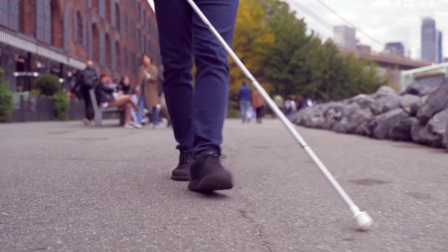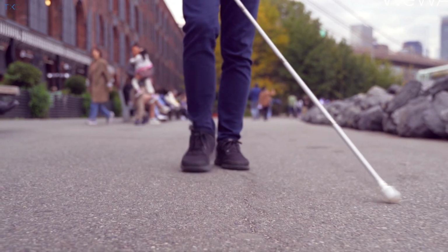Of course, the cane also has a connection through Bluetooth with a smartphone, and they run apps on their smartphone. So they can use plain language to give instructions or interact with the cane, to tell it something like show me the nearest coffee shop or take me to a bus station. The cane or the app will respond with a more accurate navigation direction and give them turn-by-turn instructions to go there.